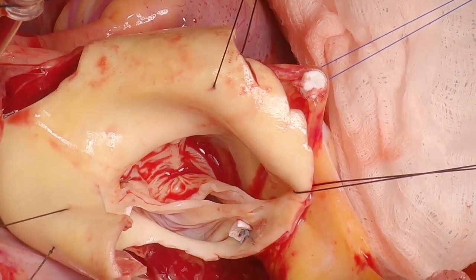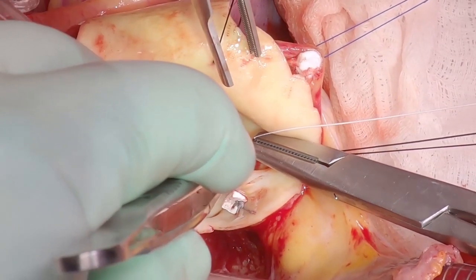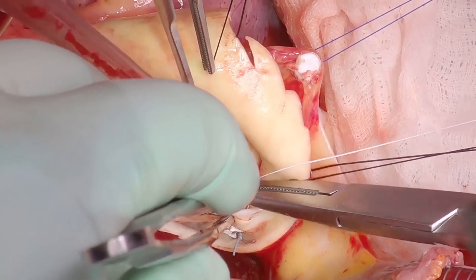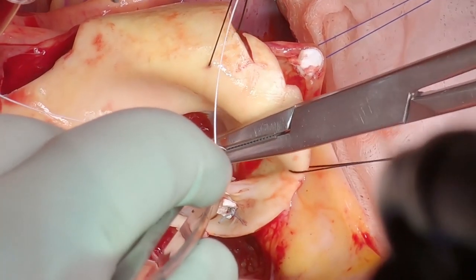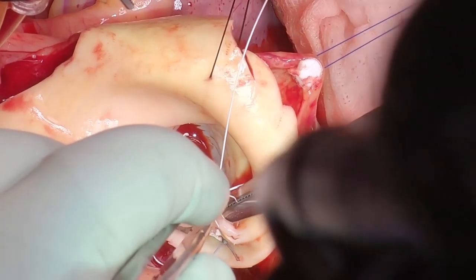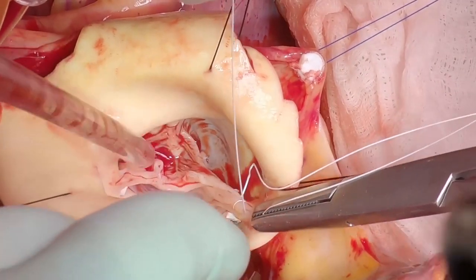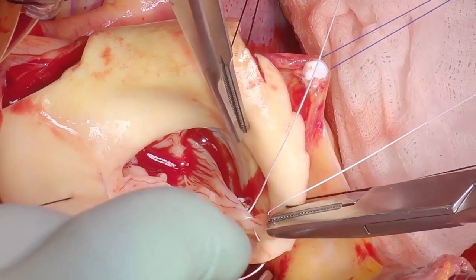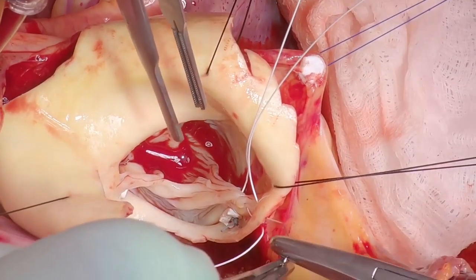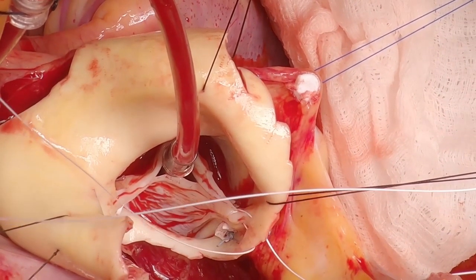Gore-Tex sutures are placed at the leading edge of the commissures using an over-and-over figure-of-eight suture, then hitched up on the outside of the aorta to bring the height of the leaflets to a higher level. We've shown that this improves the durability of repairs long-term, not only for three-leaflet valves but also for bicuspid valves. That's about three to four millimeters higher on the aorta, and a pledgeted suture is placed to prevent pull-through, since the tension on these Gore-Tex sutures is fairly significant.